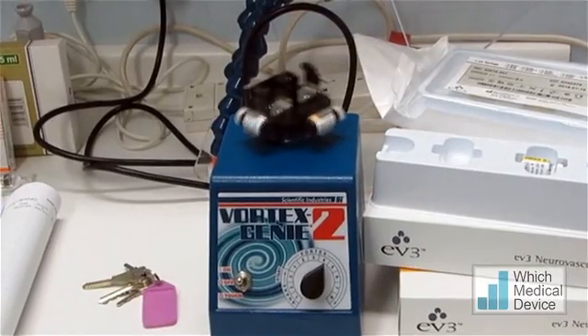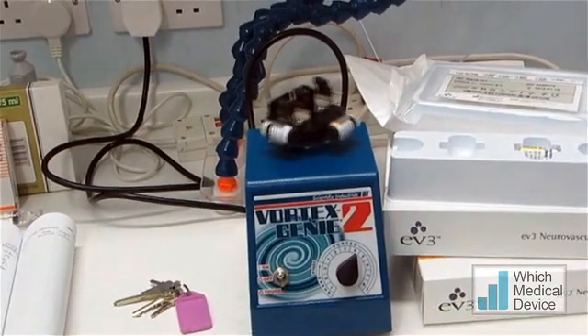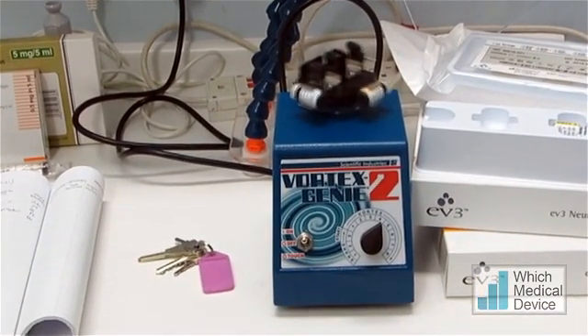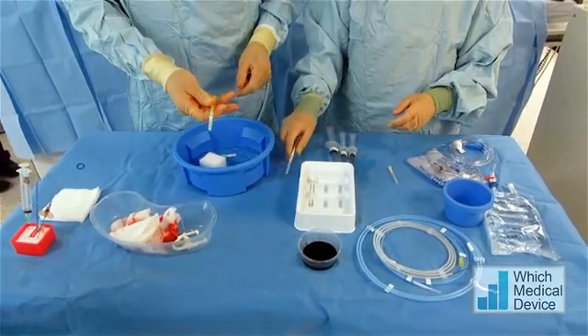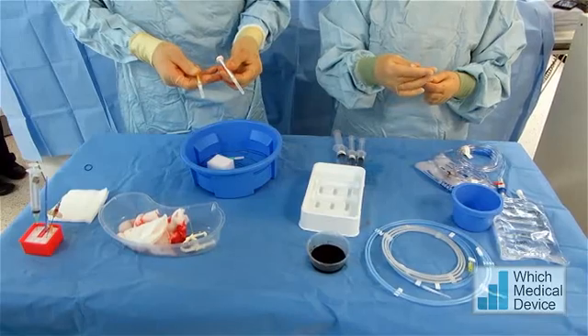This is the Onyx being mixed - it's been mixing now for about half an hour, which is more than adequate to mix the Onyx up with the tantalum powder. We've got colour-coded syringes: yellow for the DMSO and white for the Onyx, so we don't get them muddled up.